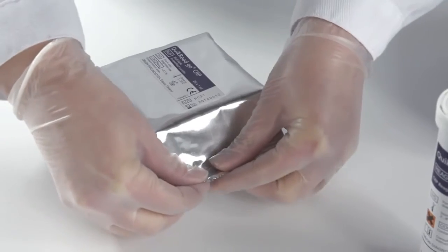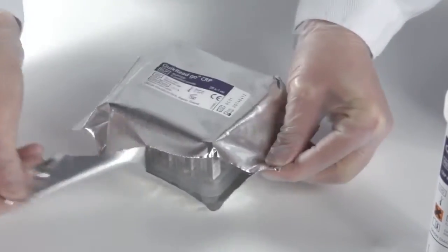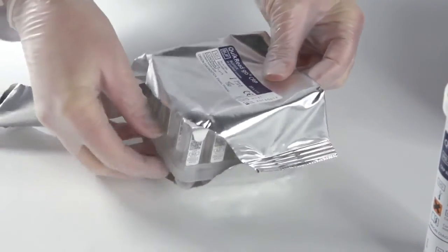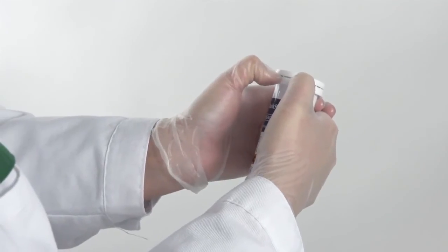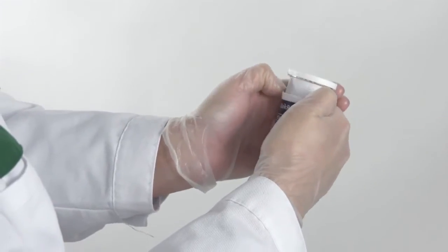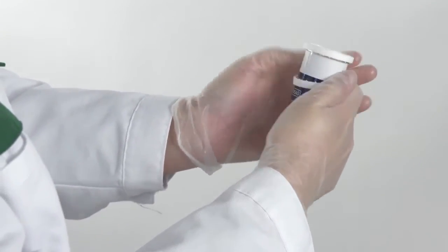Open the cuvette rack foil by tearing and take the rack out from the foil. Discard the foil. The reagent cap tube is opened by pushing the lower part of the cap down with two fingers. Discard the plastic ring.